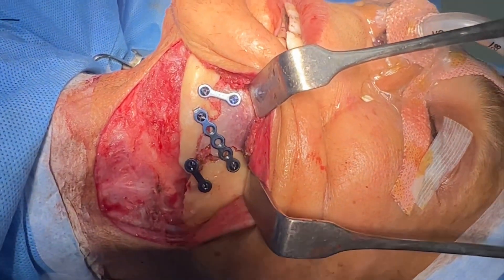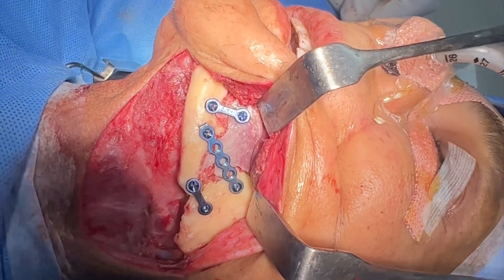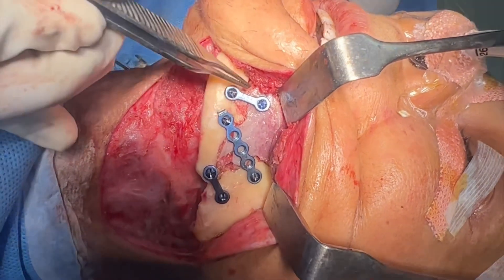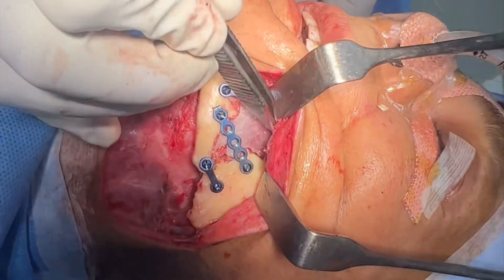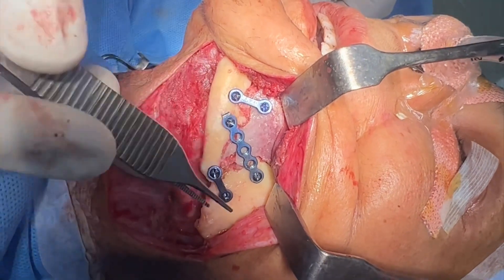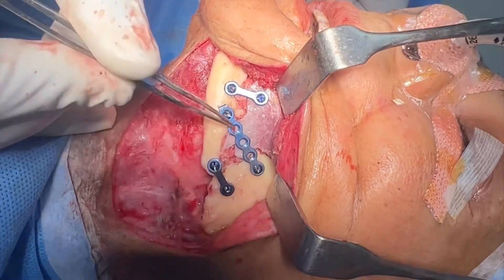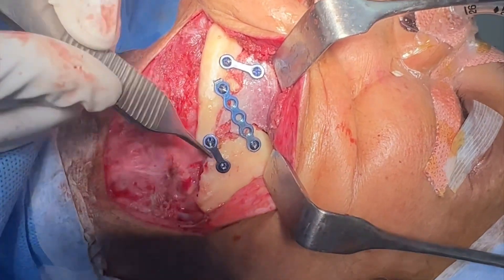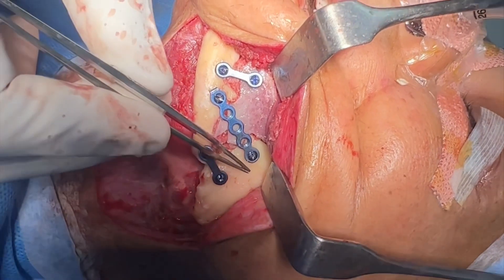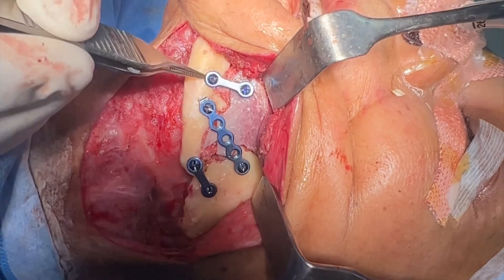That's the reconstructed lower jaw now. This patient had a pathological fracture as I mentioned earlier. We've harvested the bone from the iliac crest and made it fit like a jigsaw puzzle. You can see the change in color from the bone that we've harvested — it's all going to get incorporated. Small pieces of bone have been pushed in here as well to close all the defects. We've got three fixations: this one directly onto the two remaining pieces of bone, likewise this one, and this one onto the graft and onto the bone.